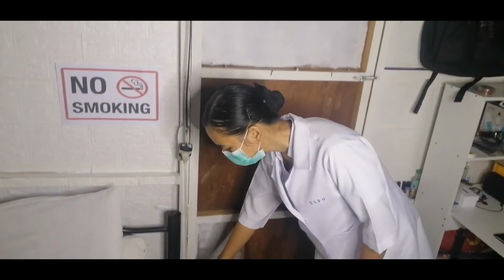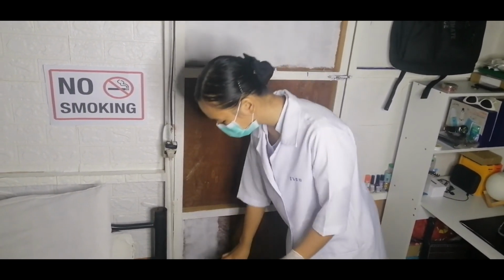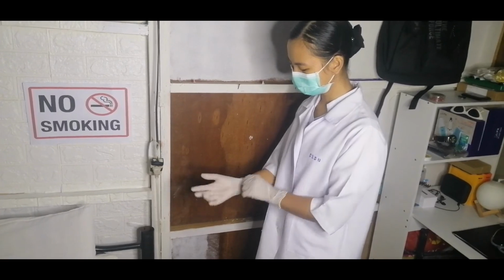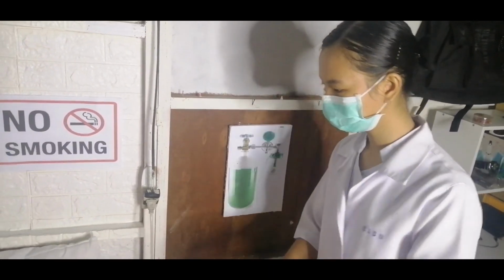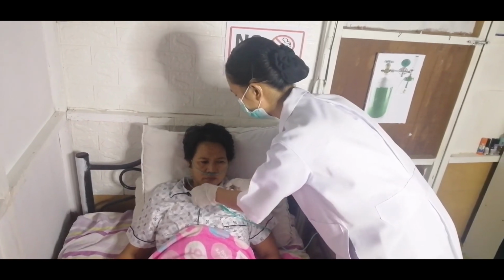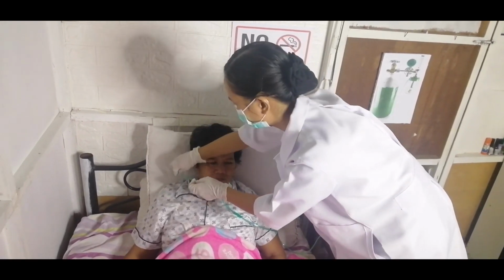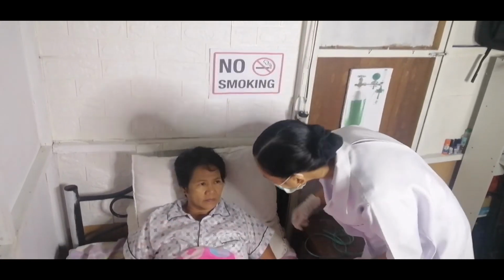Then lastly, check nares for evidence of irritation or bleeding.